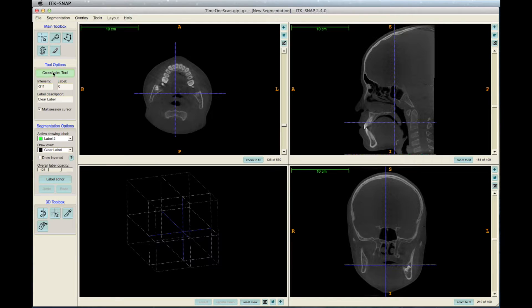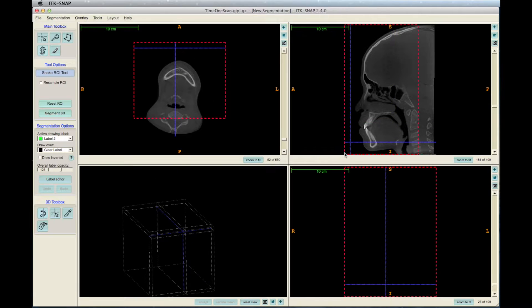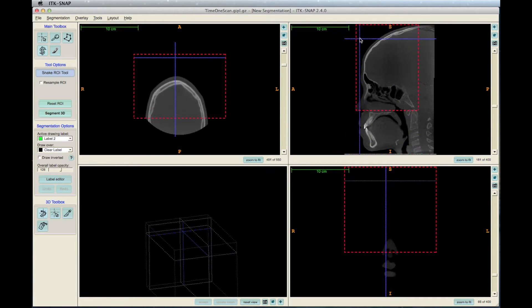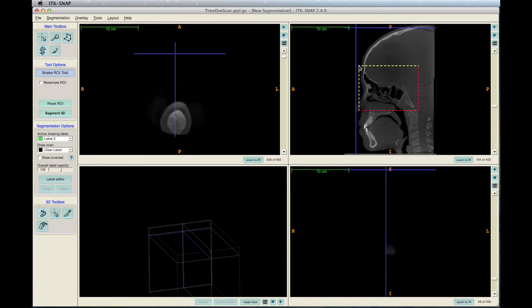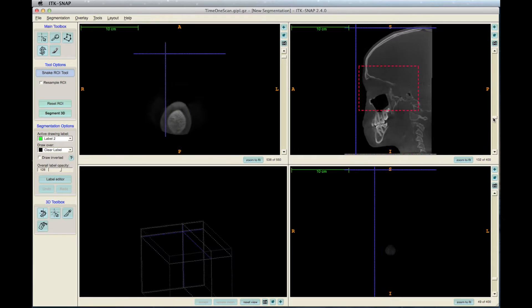To start the registration step, click on the snake icon, which is in the main toolbox on the left. Red lines will appear in your window. Move the lines to the region of interest in all the views — coronal, sagittal, and axial. Here, our region of interest is the cranial base.